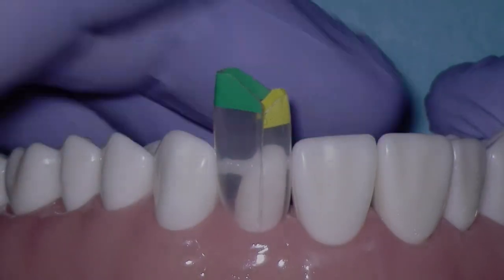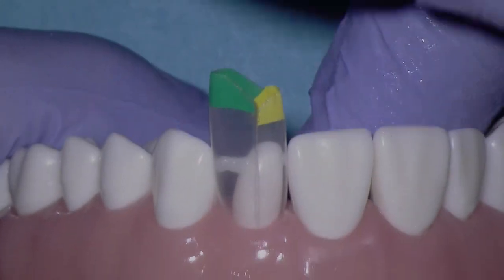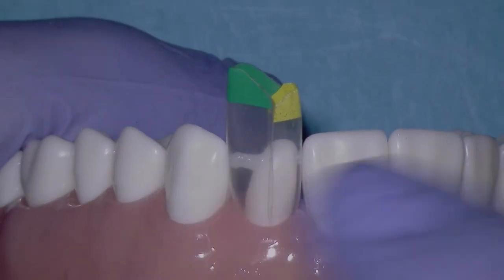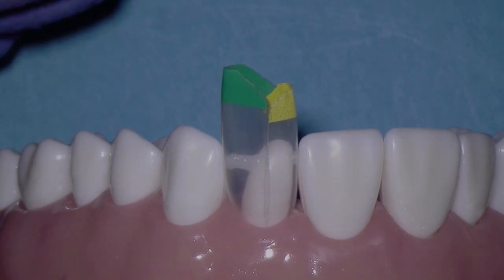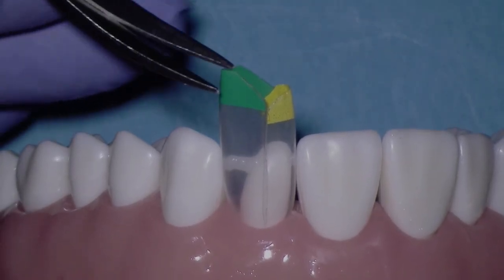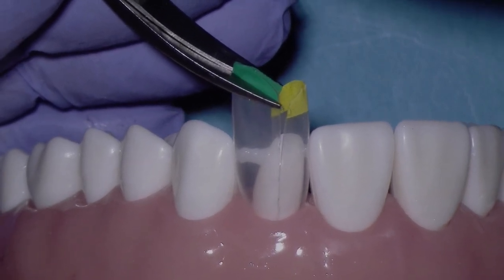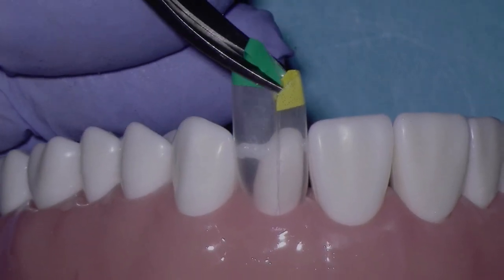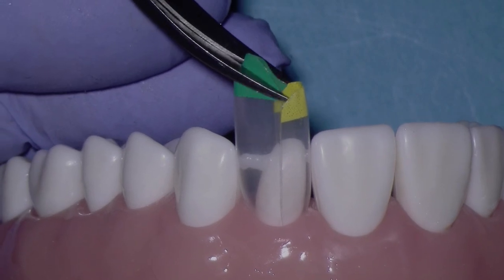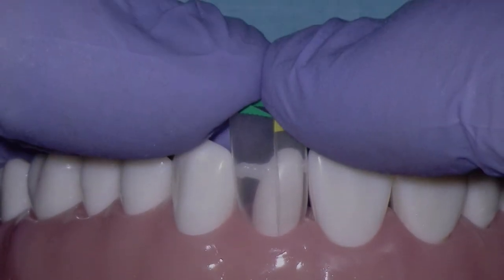So a couple of things we're going to do before we injection mold. I like to have the matrices with the same height so I can tap on them and keep them in place, and it's also a visual landmark so that I know if the matrices have moved. So I'm going to go ahead and trim the distal matrices so it's approximately the same height as the mesial matrices. So here I'm checking the matrices. I can gently tap on them.